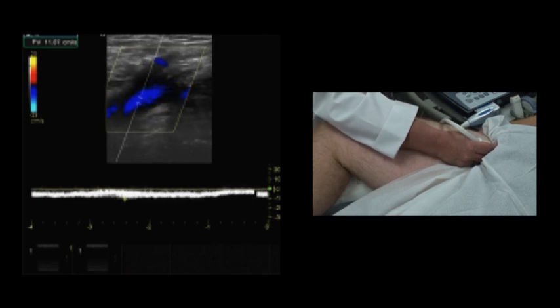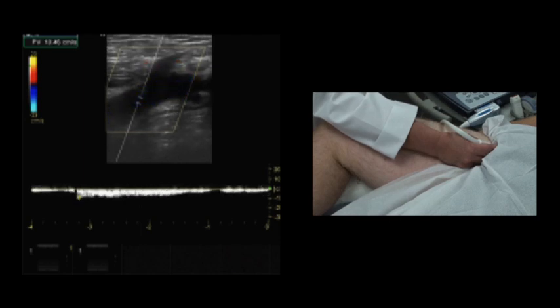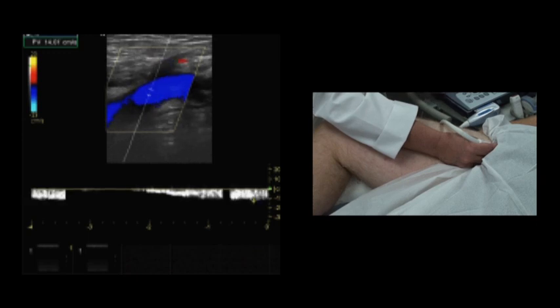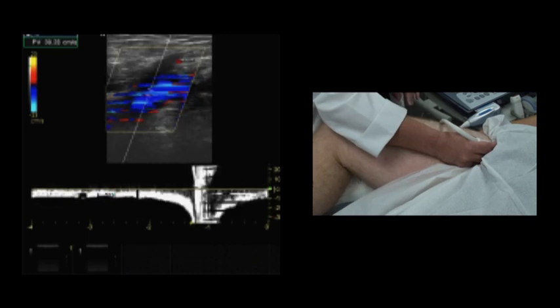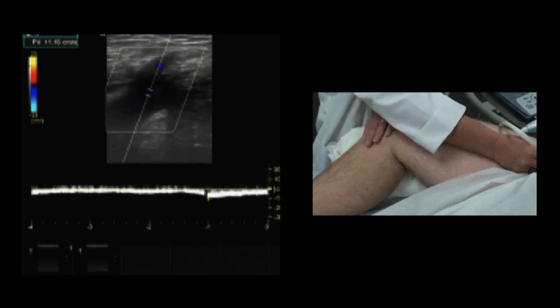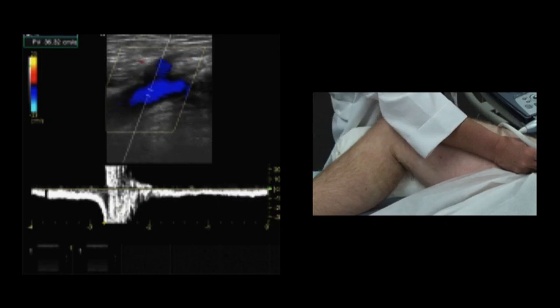And then we will now do a distal augmentation. The distal augmentation is forcing the blood upwards, and if there is a blood clot, a thrombus, there will either be no augmentation or there will be a reduced augmentation. In a normal venous system, we will have a very good distal augmentation, which I will demonstrate. This is an excellent distal augmentation within a normal system. Okay, one more time, a distal augmentation. And this is a good response.